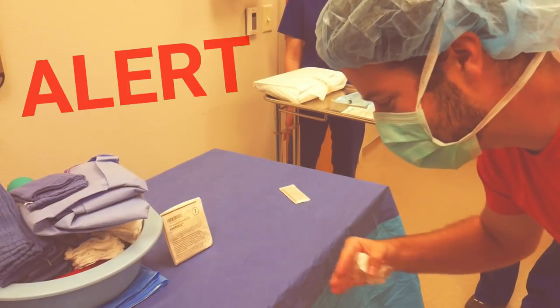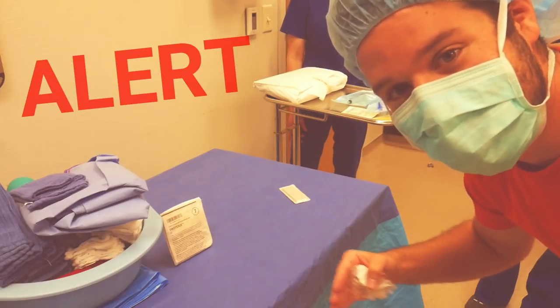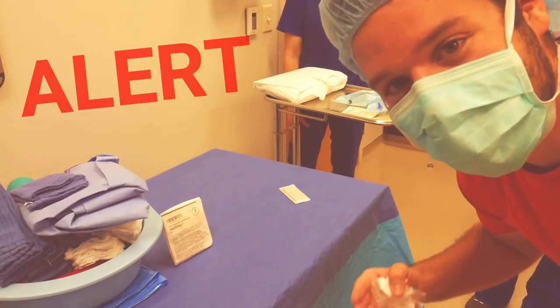Before you all start hating on me — yes, I know — I'm supposed to be 12 to 18 inches away from the field when you're opening up a package.